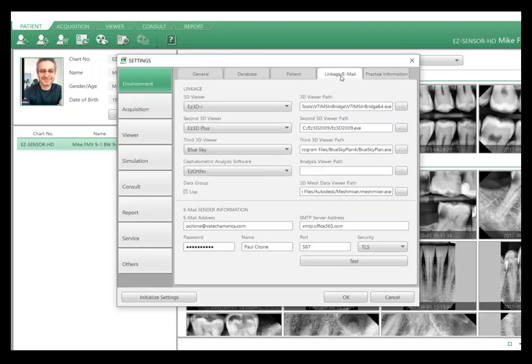Yeah. I have a question coming in about getting that SMTP server address. Yes. And I think the answer is getting your IT department involved to get that all set up, because some office emails, we need to find the password and then get that SMTP server and look for the port and different securities there. And then once we test, that should go through and work. So oftentimes we'll get your office IT involved in getting that set up. Yeah, because if you're usually dealing with a server, the SMTP is usually different.